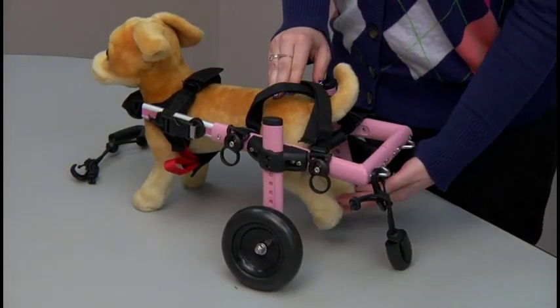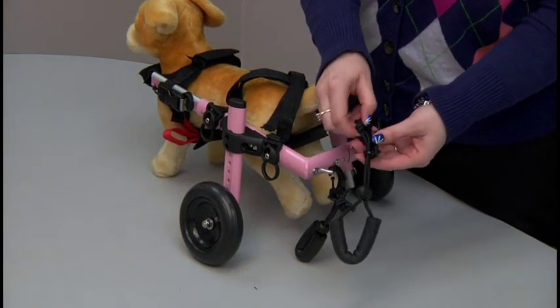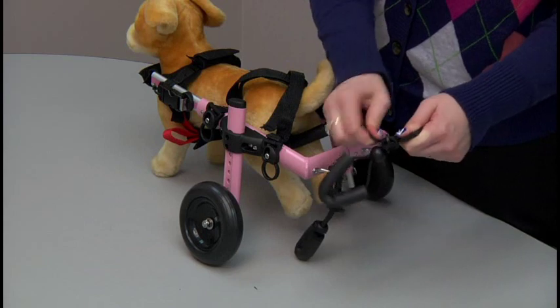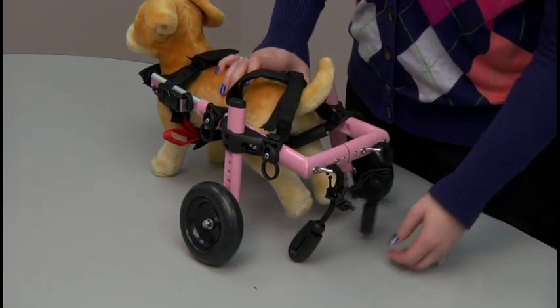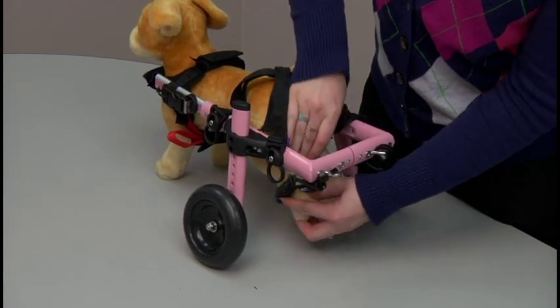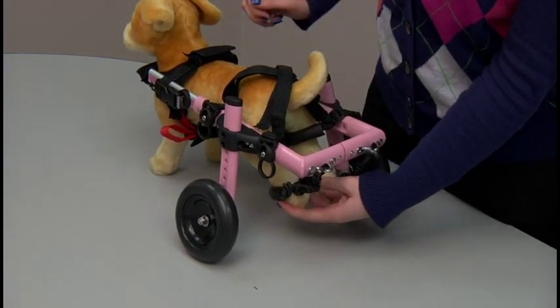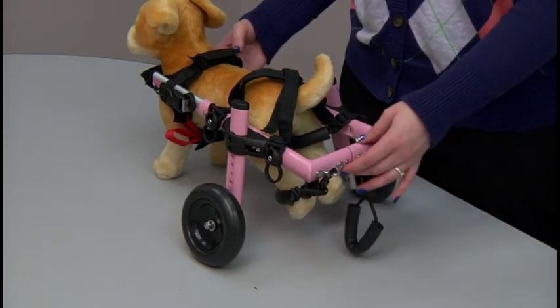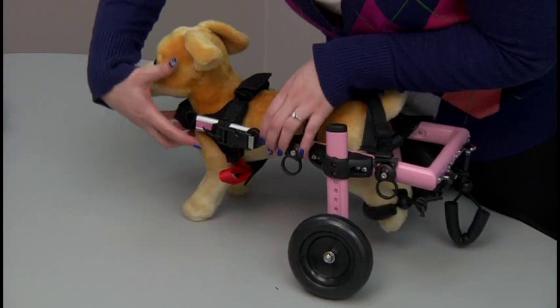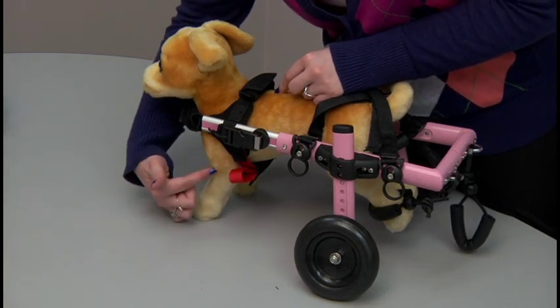For dogs that don't have use of their back legs, you're going to want to use the stirrups. The stirrups simply hang off the back end of the cart. For dogs with shorter legs, you can adjust the stirrups by sliding the hook down the elastic and wrapping it back around. Grab the dog's back leg and put it through the stirrup, then adjust it by sliding the push button down — this holds the dog's back leg up. Make sure the extender is ending at the middle point of the dog's front leg — it should not extend past the front leg nor be behind it, but right in the center.